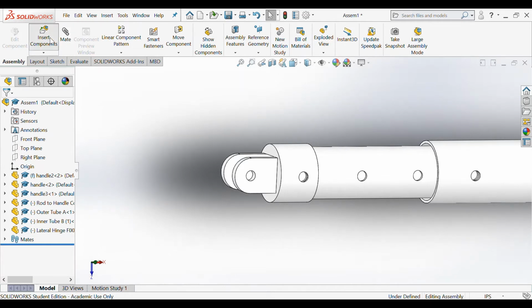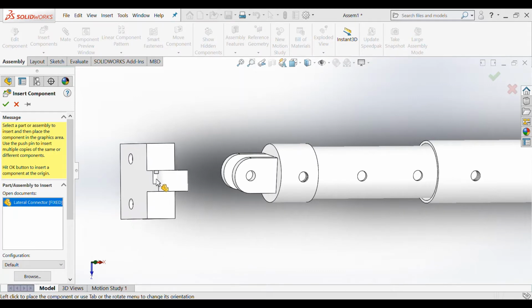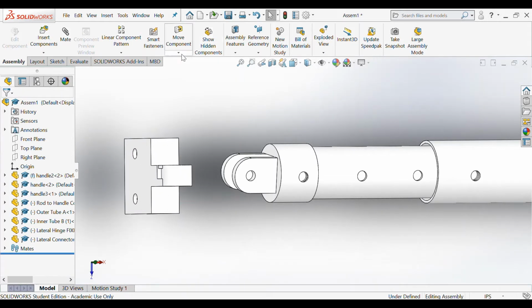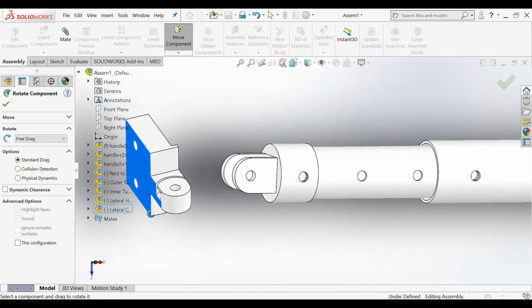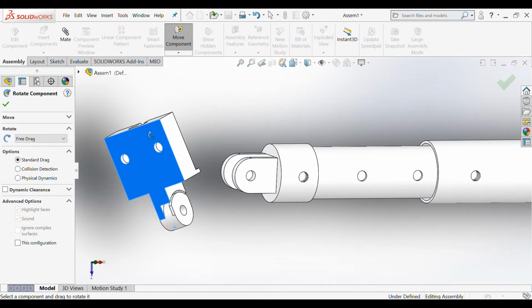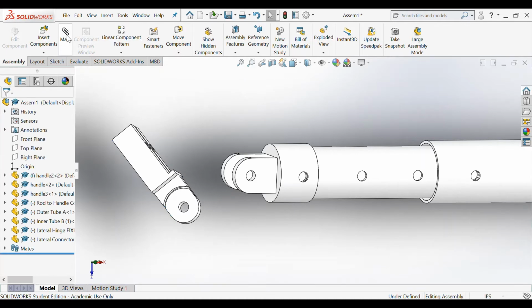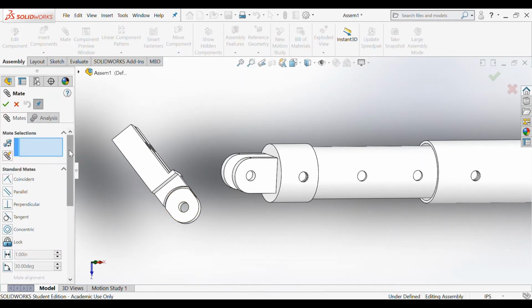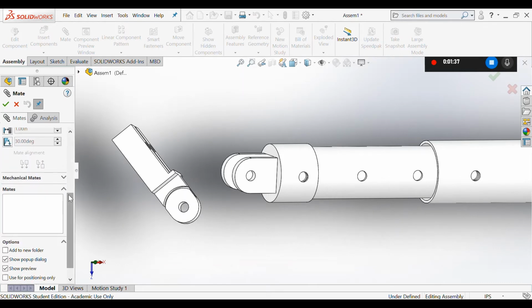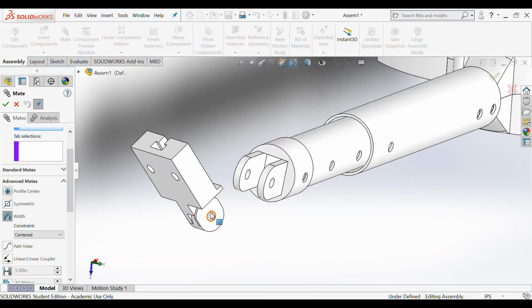Next, I'm going to insert the lateral connector piece. And I'm going to rotate the component to allow for an easier assembly. And I'm going to go on ahead and use an advanced mate. So what we're going to do is use a width mate, and this is going to place this hinge piece in this hinge piece.